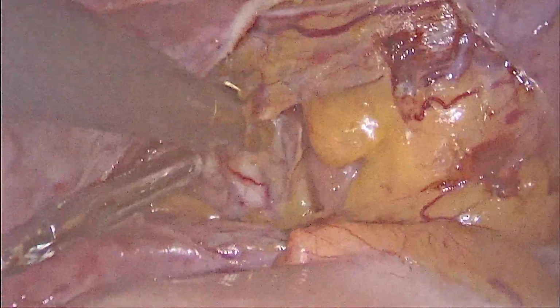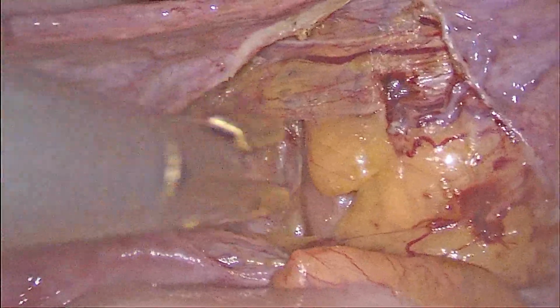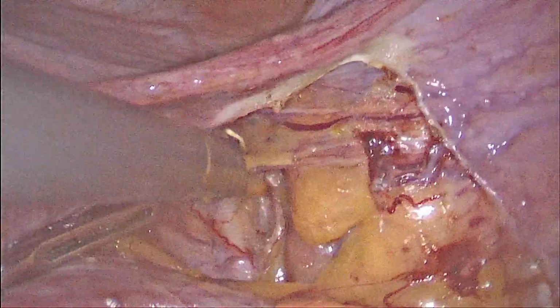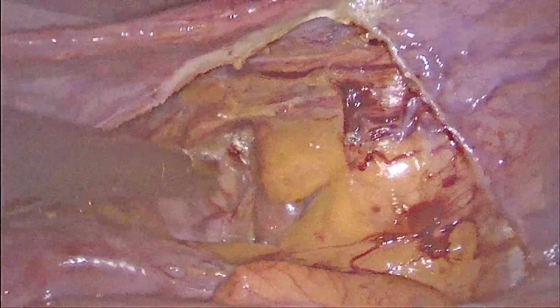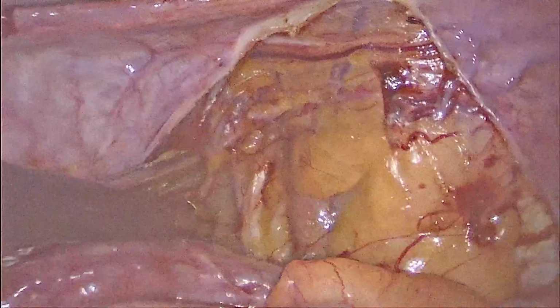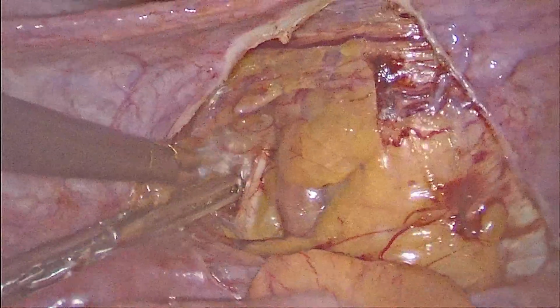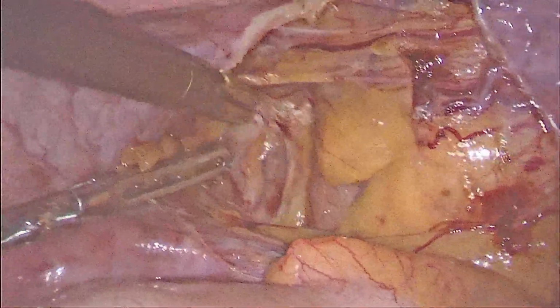If you continue the dissection anteriorly, we will identify the uterine artery, the first medial branch of the anterior division of the internal iliac artery, which crosses from lateral to medial side. Do not hurry in this plane to do the dissection.